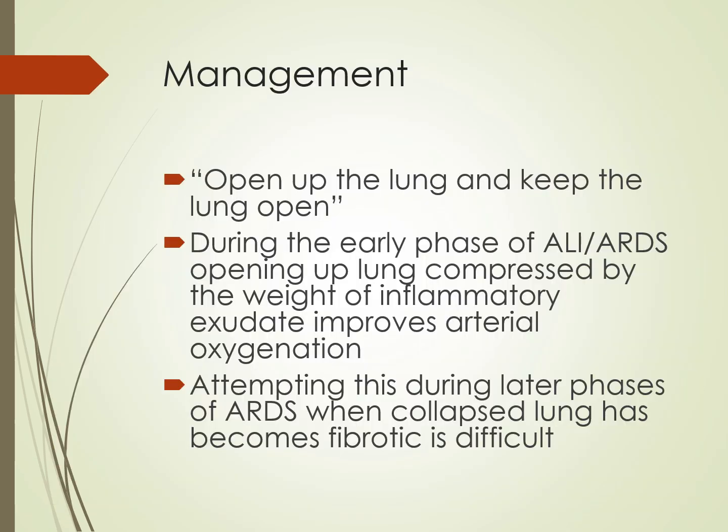I wanted to share with you an approach to managing patients with ARDS, and this is called the open lung approach to ventilation. This involves high levels of PEEP in combination with low tidal volumes as a lung protective strategy. The goal is to use low tidal volumes in a range of 4 to 8 milliliters per kilogram and limited plateau pressures under 30 centimeters of water. It is now widely considered the standard of care in acute respiratory distress syndrome.